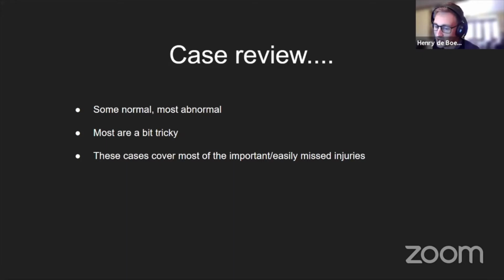I think what I'd like to do is try and highlight some of the important fractures or the easily overlooked injuries, so that if you're looking at these films overnight or trying to make a decision, you have seen most of the important pathology and the ones that you can miss. And then if you've seen it before, you'll know what to look for, and hopefully we'll spot it. And if we get to the end, and I've got about 30 cases, so we might not have time to go through them all, but hopefully we should cover all of the injuries that you'll likely ever see.